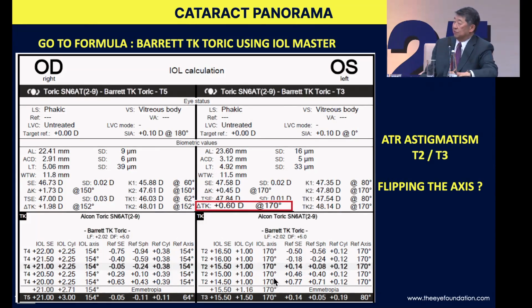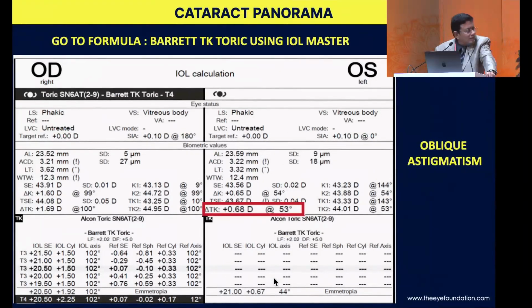But gosh, if you have an EDOF or a multifocal, the patient in the United States is paying extra for a broader defocus curve, lower contrast, and every single point will be lower if you have more than a half diopter of cylinder. So there, you really want to be aggressive and do a touch-up with an astigmatic keratotomy if you want. Great.